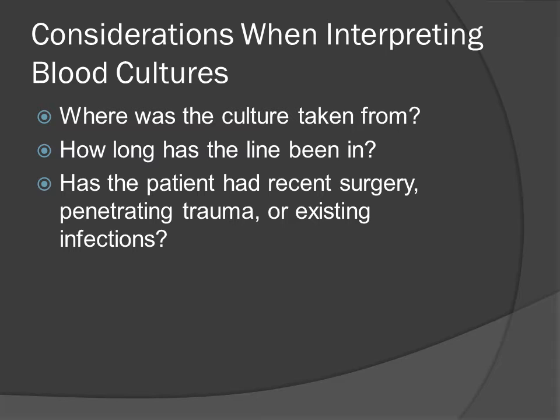Careful technique is critical to avoid contamination of the blood culture media by normal skin flora during the process of collection. It's important because normal bacterial skin flora can also cause systemic disease, such as infective endocarditis, and in some circumstances, blood culture contamination can make it really difficult to distinguish between false positive results and a true infection. Measures to reduce contamination include effective disinfection of the venipuncture site and avoiding blood culture collection through existing intravenous lines.